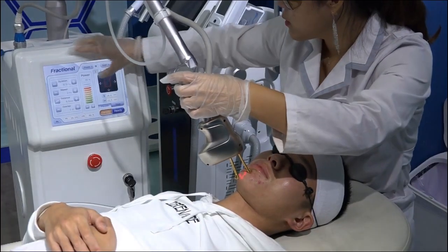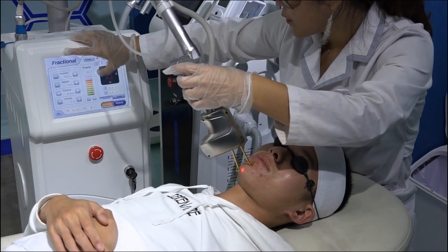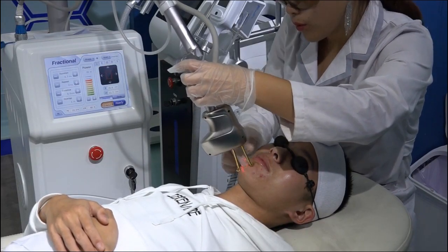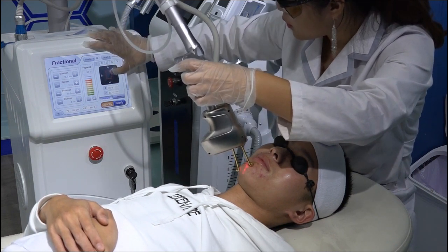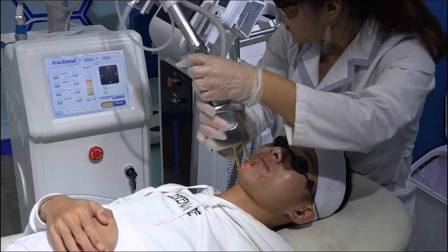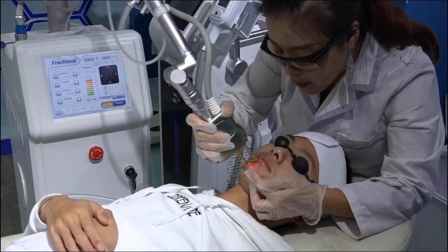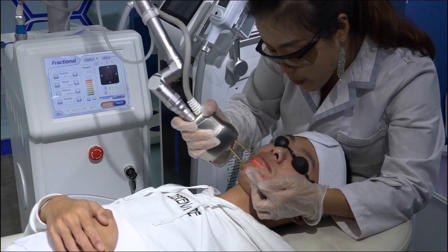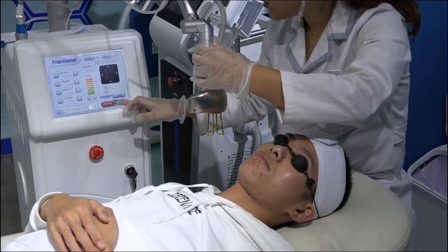If we change the size here, here also has the preview. Okay, if we choose this size, we can test. Here and here, not repeating is okay. Here we can have a preview performance. Okay, now it's ready.